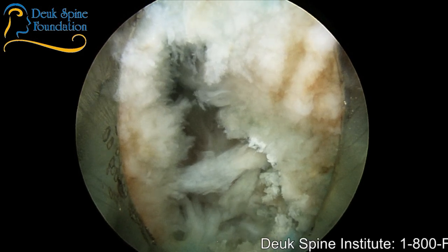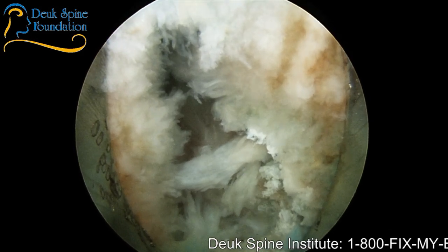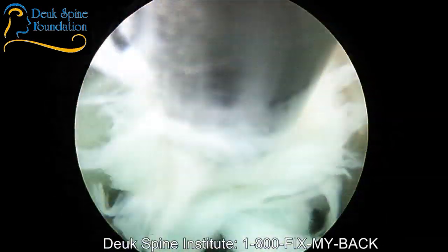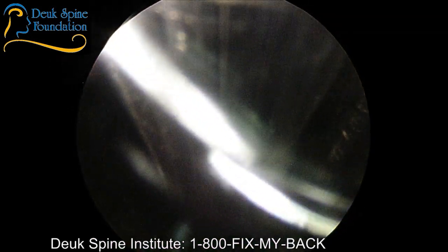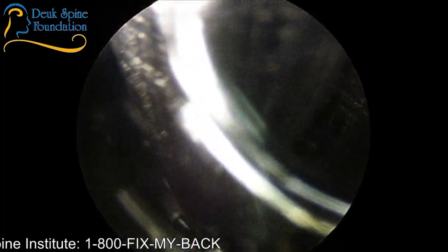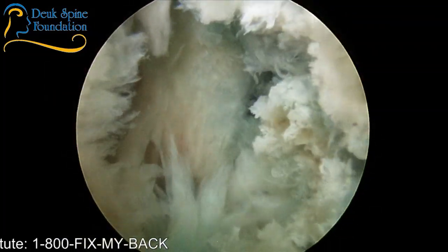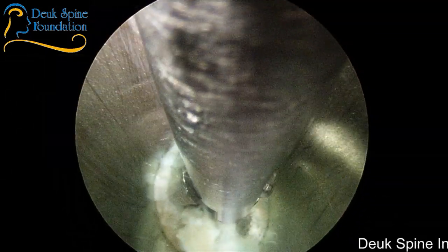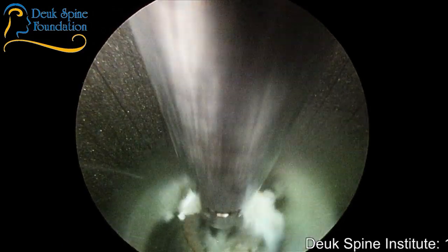But when someone has chronic back pain, there's really very little they can do to fix it on their own. There was a piece of herniation inside the disc, but the reason it's inside is because we pushed it inside with the dilator. Remember when I shoved the dilator in? It actually pushes the herniated fragments inside the disc, which is one of the advantages of this technique that I'm using. It's called the inside out. You start inside the disc and you work out.